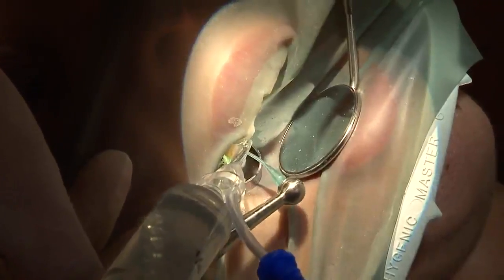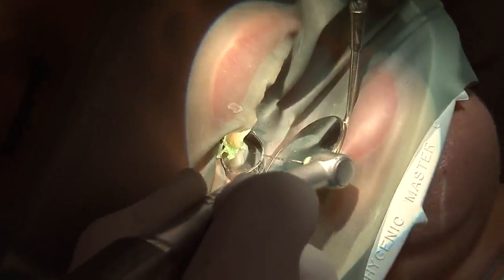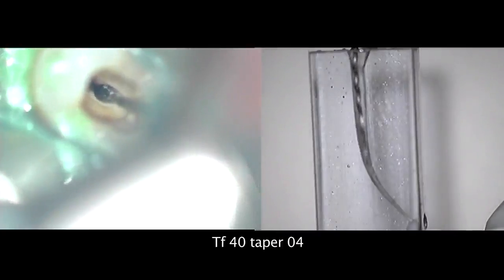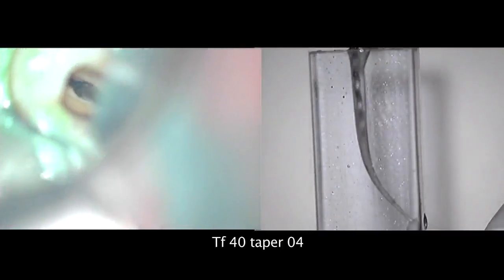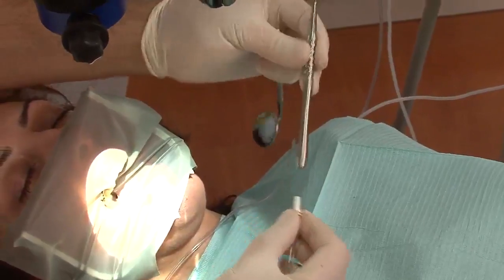I use the TF40 taper4 for apical measurement. I use the 40-04 in TF5s due to the flexibility of the alloy — I can make the jump from 25-06 to 40-04 and enlarge my apical area to size 40 for different biological considerations. You can see that the debris are concentrated in the apical area of the file.